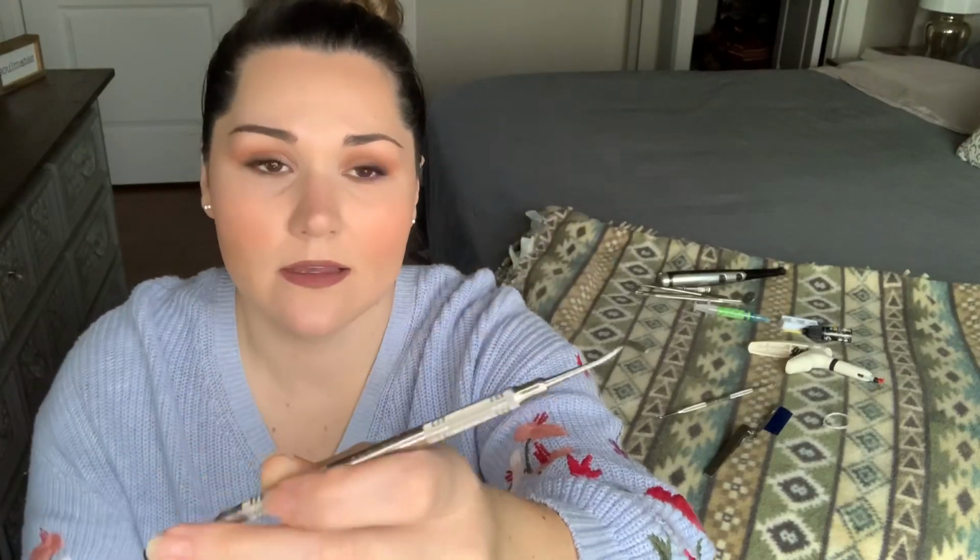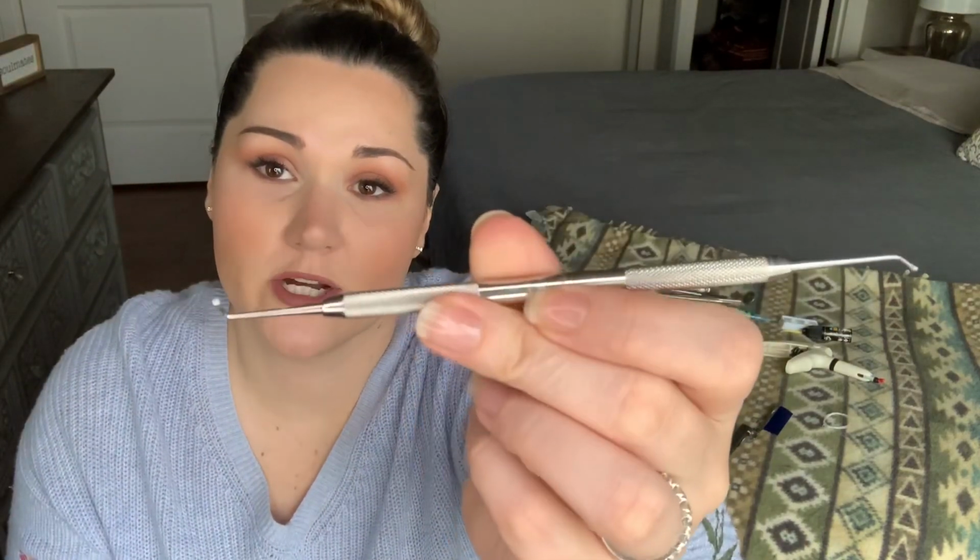an anterior composite, a front tooth, he will want this guy here. And this guy here is called a Greg. It's smooth here on the ends, so he can kind of apply that composite there on the facial if he needs to. Or if he's doing a posterior, he wants the ball burnisher, so he can pack that in there.